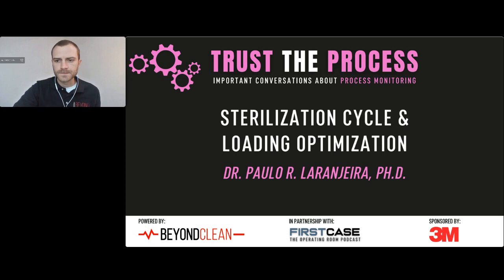What I normally try to do is to look into my process. Let's say I have a 90-minute total cycle time. I would rather work to reduce that 90 minutes to 60 minutes and have 2 cycles.